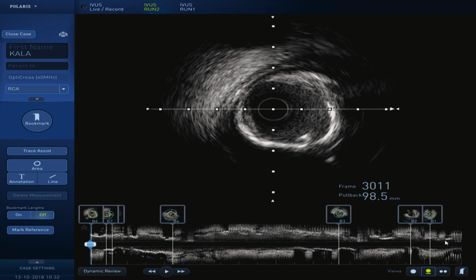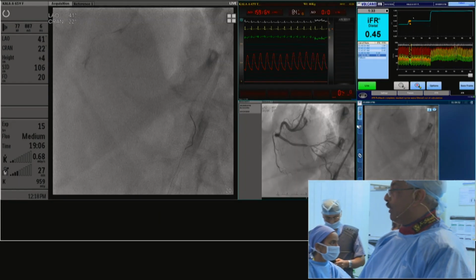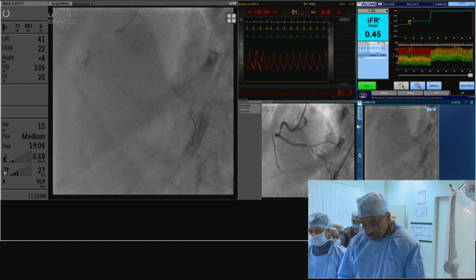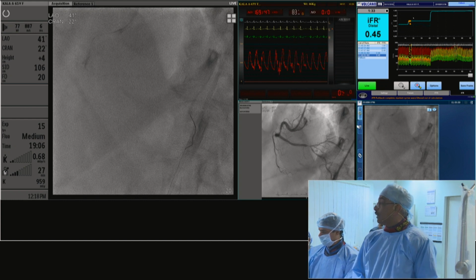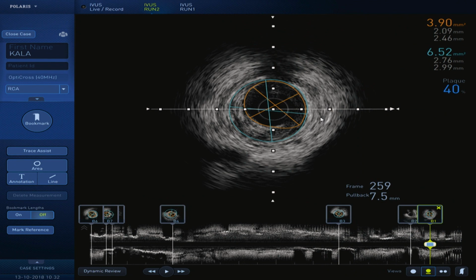Okay, so we've got some more information. The distal diameter, if you could tell us. So this is coming across as probably, I would say, a 2.75. I'd probably take a 2.25 as we agreed. Yes, it's about 2.5.